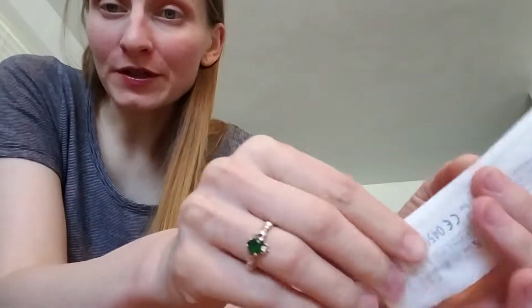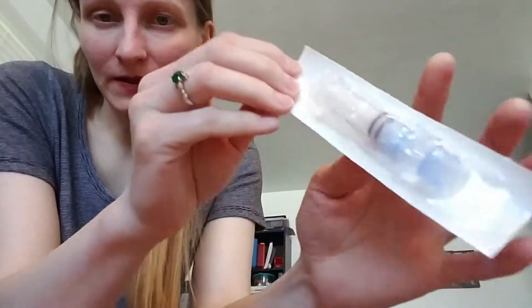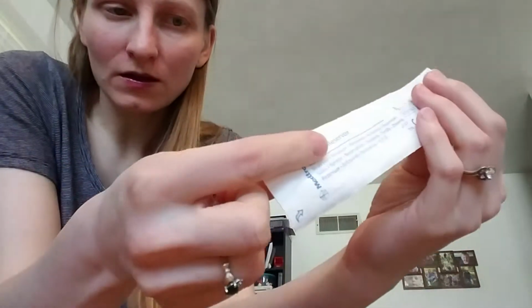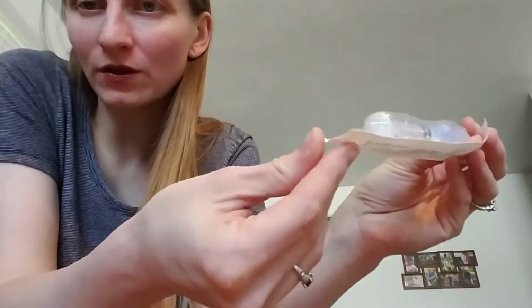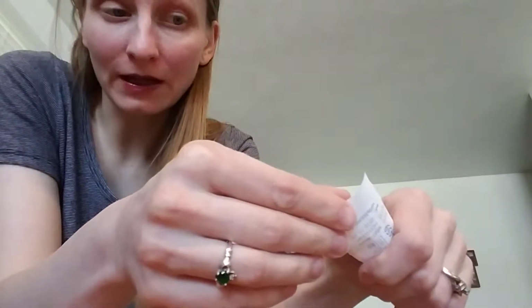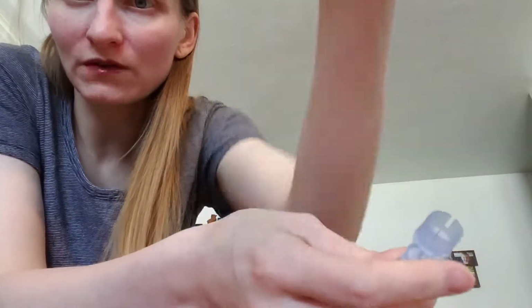I gotta refill my cartridge because I'm out of insulin, so I'm gonna do that on film. This is the cartridge or reservoir. There are different size ones. I use the 300 unit one because I can get more insulin out of it and not have to change as much, which also means I require less pump supplies, which means less money. They are pricey.